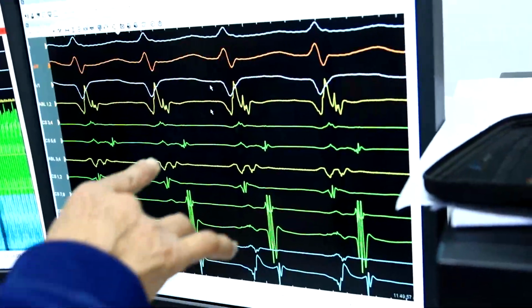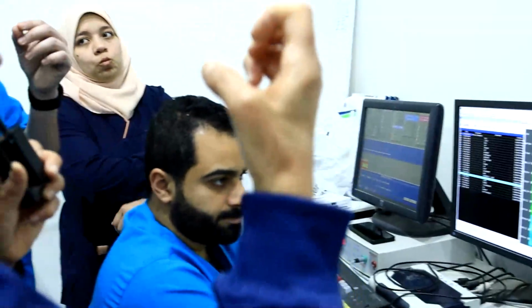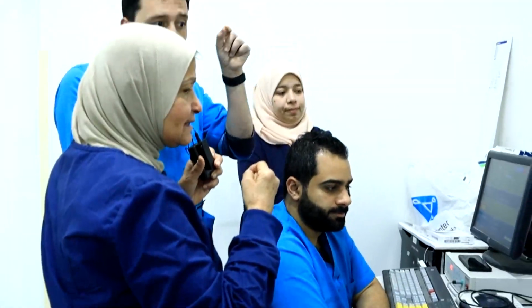And then we got this in the anterolateral part, and I saw an accessory pathway potential. I said there is a potential between the V and the A. So we ablated here, and it gave tachycardia termination from a single shot, and then reinduction.